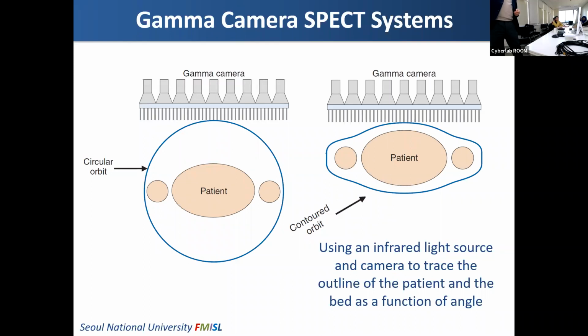Actually, this function is independent from the concept of the digital SPECT. But both functions are very modern, and they still use iterative reconstruction and other procedures. Whether we use iterative reconstruction or other algorithms is also independent from these functions. But in most new cameras, iterative reconstruction is available. Especially in SPECT CT, iterative reconstruction is very vital.